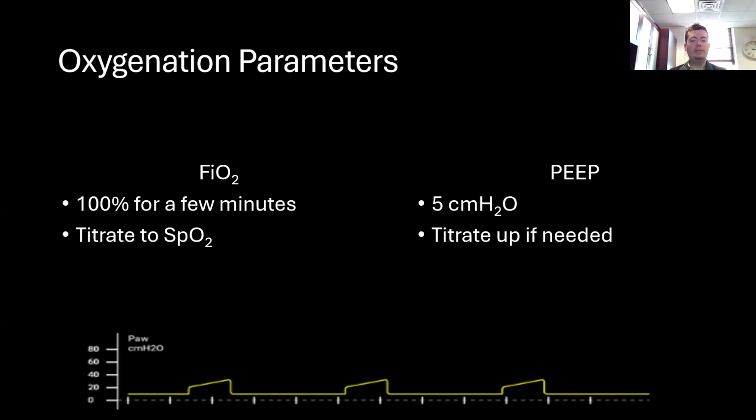And you don't have to be afraid to titrate this up as needed, particularly if you're finding that you need to be at a higher FiO2. Going up on your PEEP a little bit might be able to help you bring that down and avoid some oxygen toxicity.